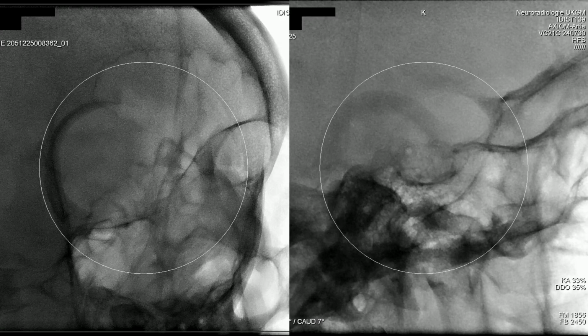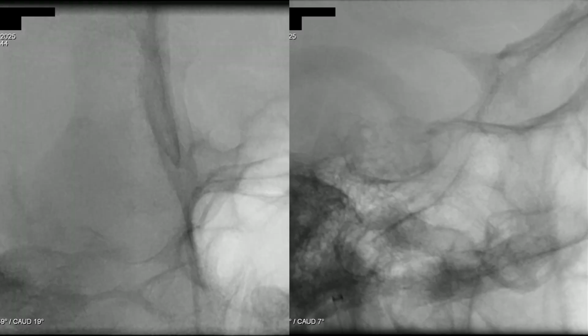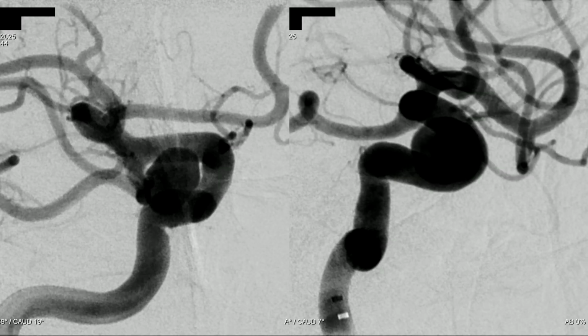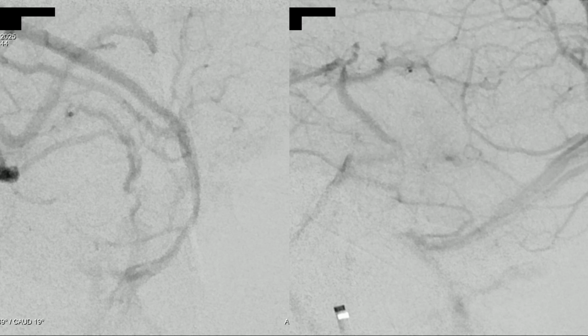And now we need a 2D angiogram, which we will use as our roadmap. And here is our working position. We still see the contrast agent swirling in the aneurysm sac.